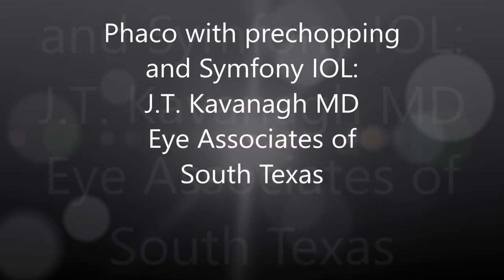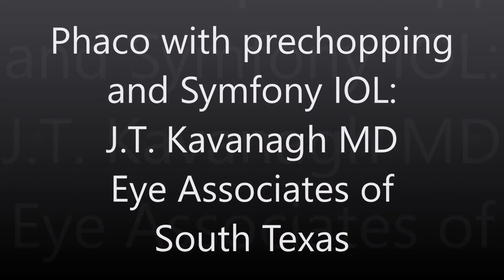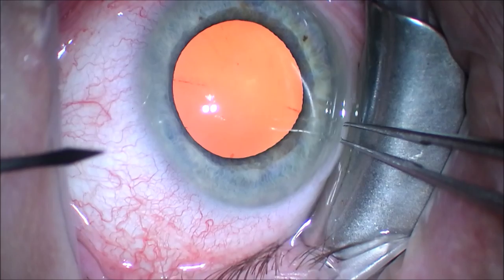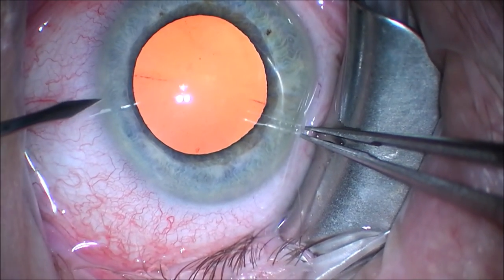This is Dr. Kavanagh of Eye Associates of South Texas. I'm going to show you a case here of a standard cataract extraction with intraocular lens implantation. We're going to implant a Symphony Depth of Focus lens by Johnson & Johnson Vision.